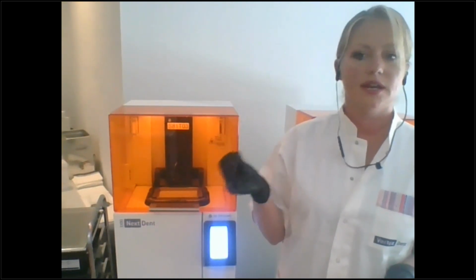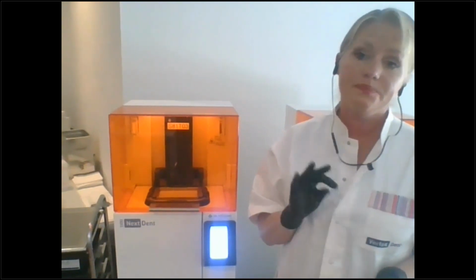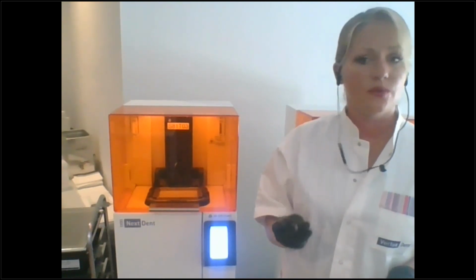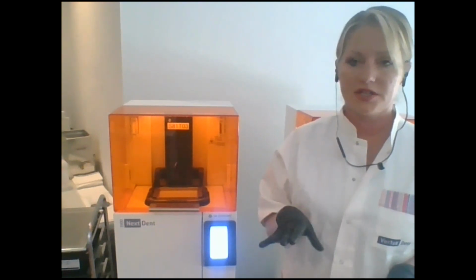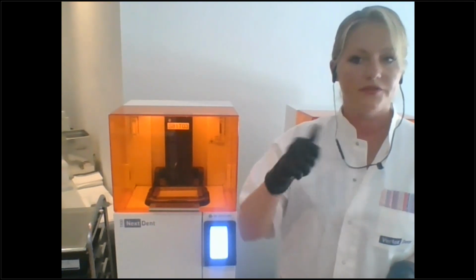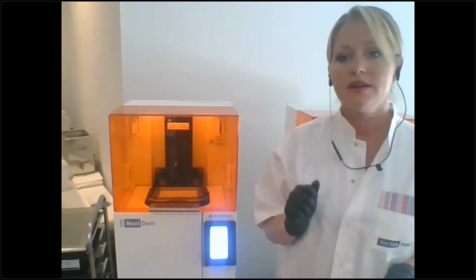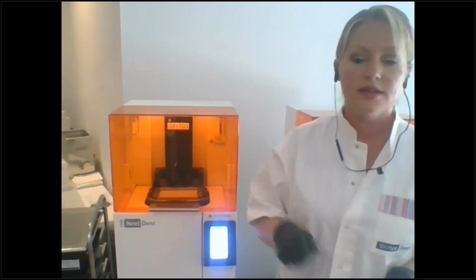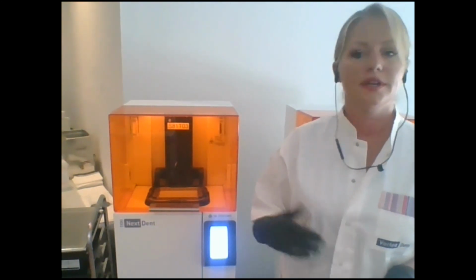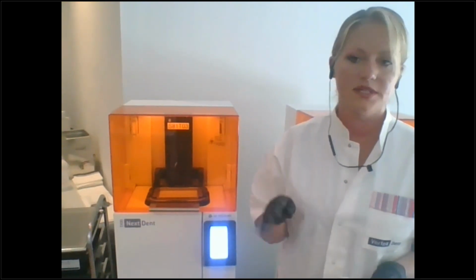The only material that I really always clean right away is my MFH, because the bleach or the N1 seems to harden up a little bit. You can tell that it's curing the longer it sits, so it's a little bit easier to clean off those supports off of important areas like your occlusal areas or the undersurface for your denture arches. So I like to clean those right away. But other than that, everything else wipes off just perfectly fine. All the supports do.